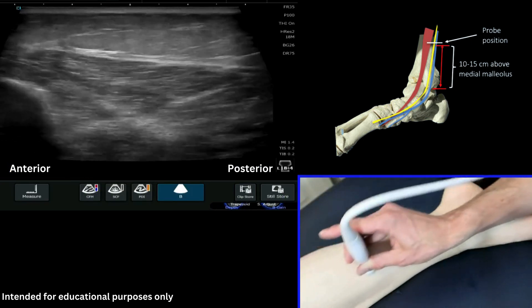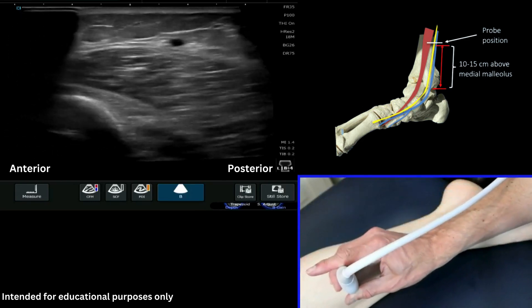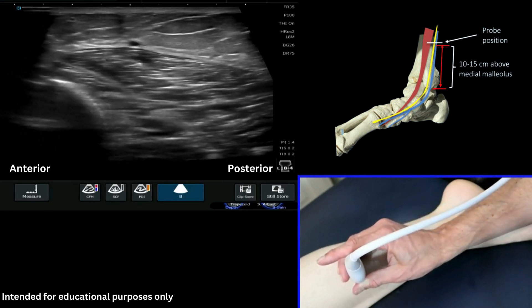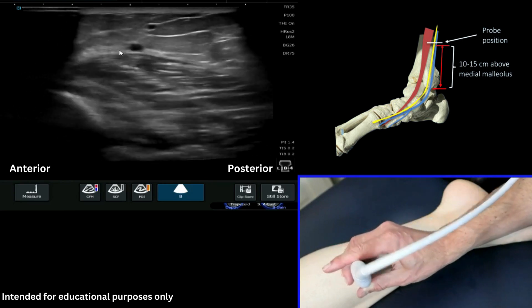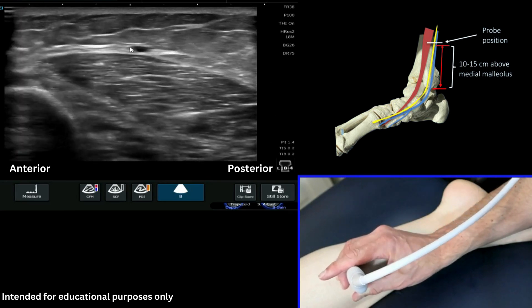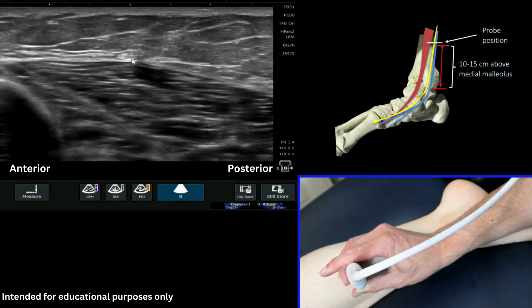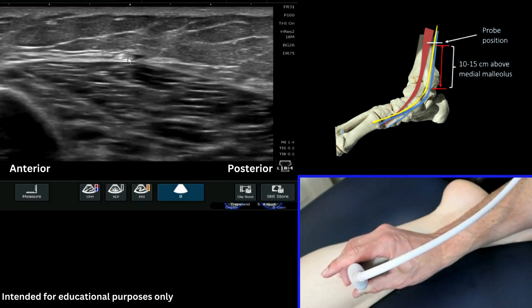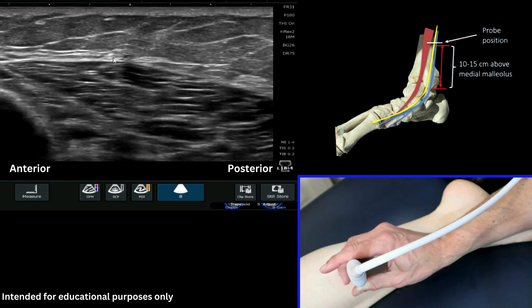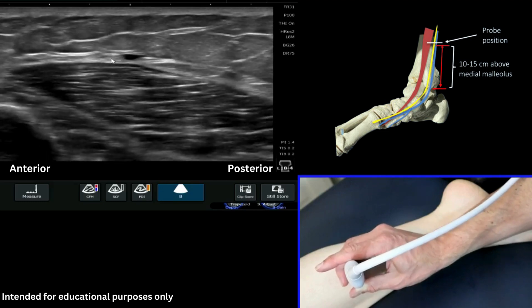It's always important when you're looking at pathology to look all the way round through these structures. Now if you just drop that a little bit more anterior you'll see a very small venous structure. If I now reduce my depth — because we're less interested in the muscles at this point — we can actually just see there's a vein, and we can confirm that's a vein by compressing it. Just adjacent to it, you can see with the probe at certain angles a really nicely identified echogenic structure, and that is your saphenous nerve.